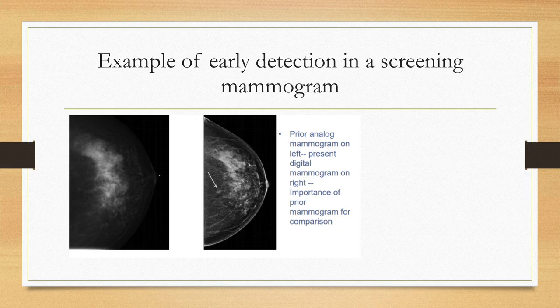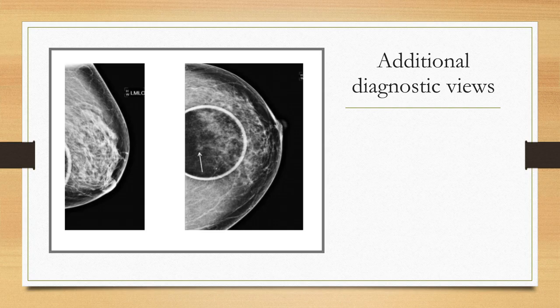So here, this patient came in for a screening mammogram, and there's this little density right here, which was new from the prior study. Screening study, so we brought the patient back in and did diagnostic workup. Diagnostic workup means additional views. Here we can see we put this paddle on the patient, we try to spread the tissue out. We see there's a persistent, about 5 millimeter density right here.